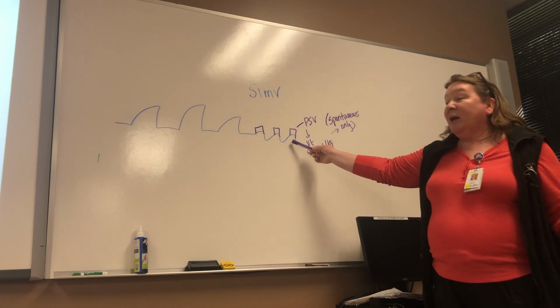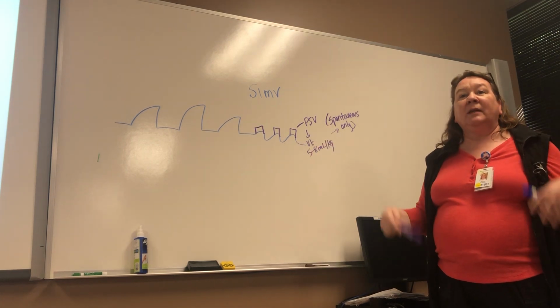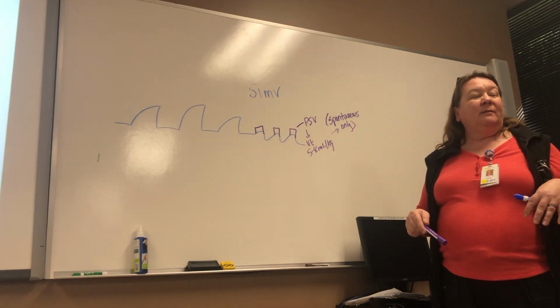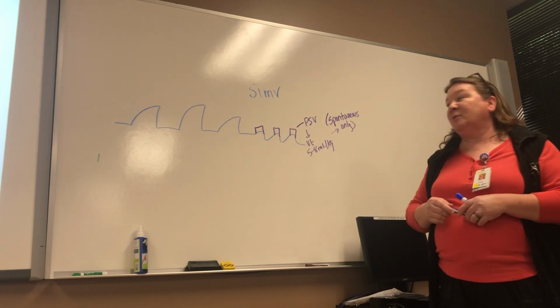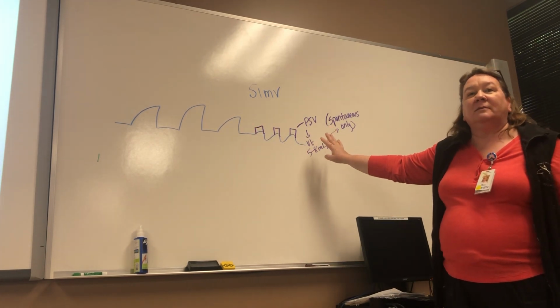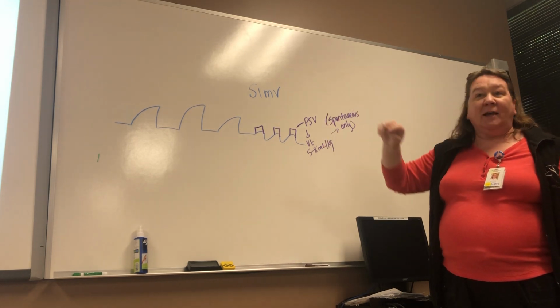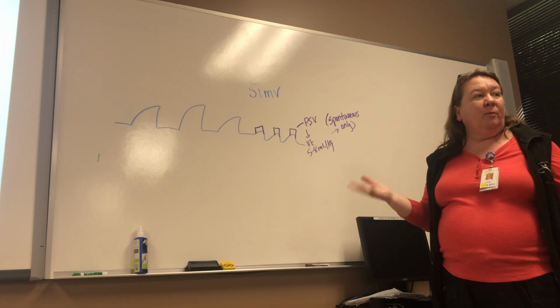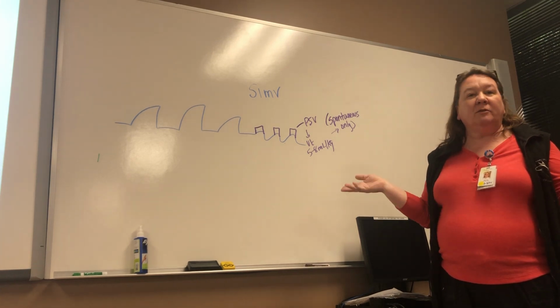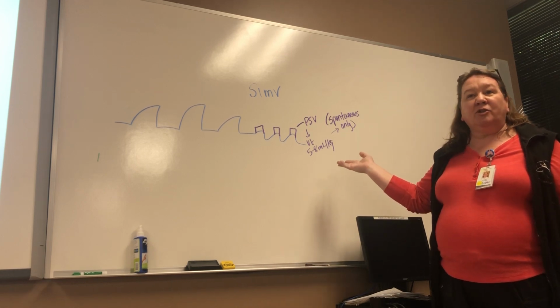So when our patient is spontaneously breathing, they're getting their own tidal volume. They're on a vent, and it's not good enough. Let's say we put them on the ventilator and their spontaneous breath, not the machine breath, is only 100 mLs. Their spontaneous tidal volume should be 5 to 8 mLs per kilogram. So probably 350, 400, just ballpark, 350, 450. So if it's only 100, it's nowhere near where it should be.